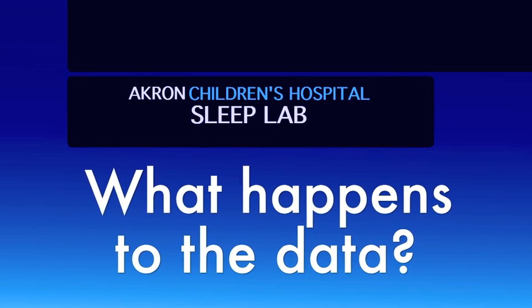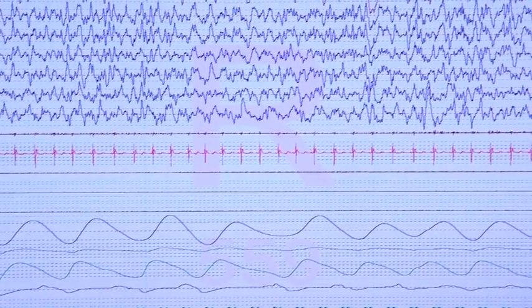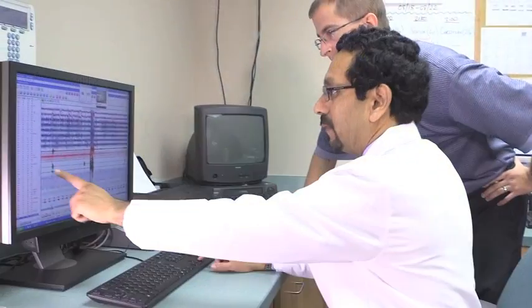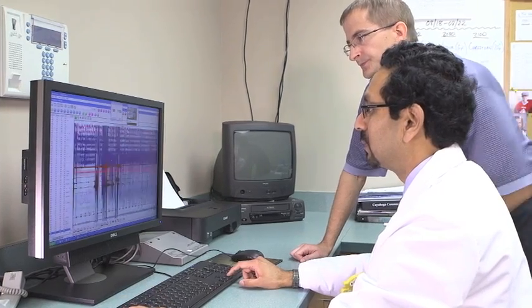We go over that data page by page. When I say page, I mean in 30-second or 10-second intervals at a time. So we may have 8 or 10 hours' worth of data to go over very meticulously. We have data from the brainwave analysis, from breath analysis, from heart waves, the gas analysis for oxygen and carbon dioxide, leg kick counts, etc. So all of this, including breathing effort at night or lack of it, which would mean apnea, is consolidated on this one computer screen that we look at very closely.